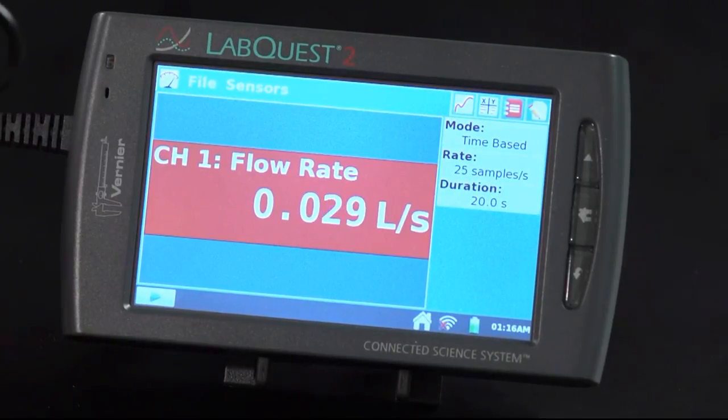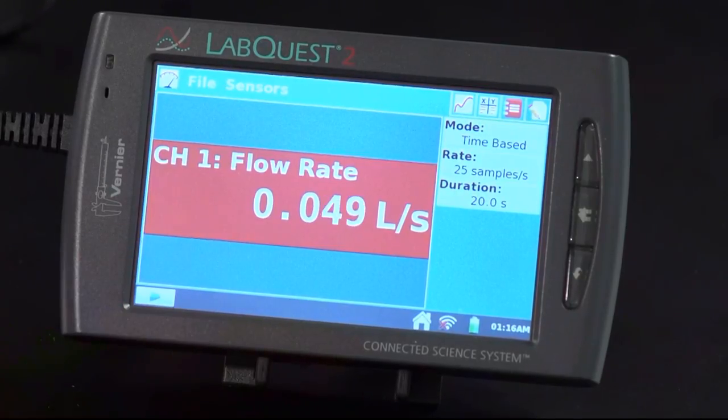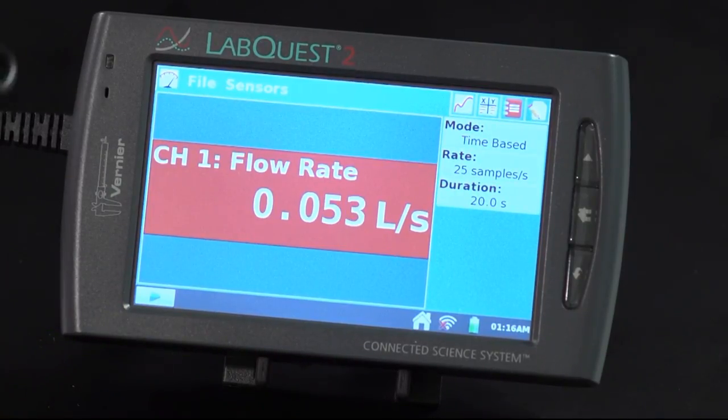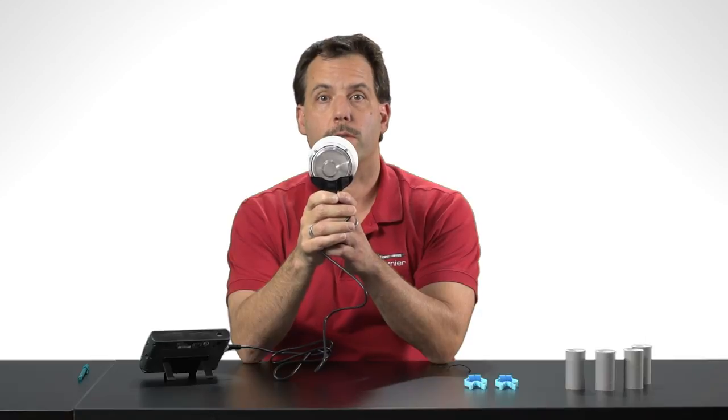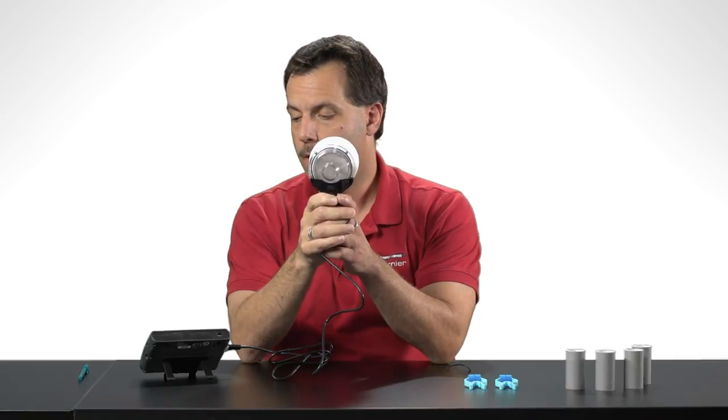And what you should see now over at the LabQuest is that there's a flow rate that's being displayed. But there really shouldn't be any flow rate. I'm not breathing through it. Nothing's happening. So I need to zero the device to make sure that there's no flow. So I'm going to be using it in about this position. So what I'm going to do next is zero the spirometer.